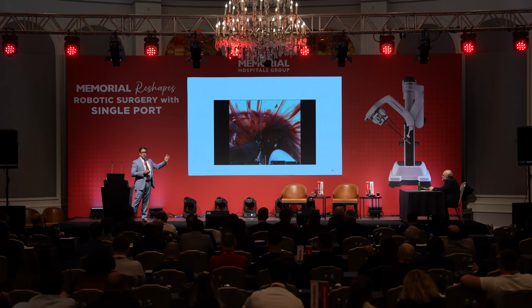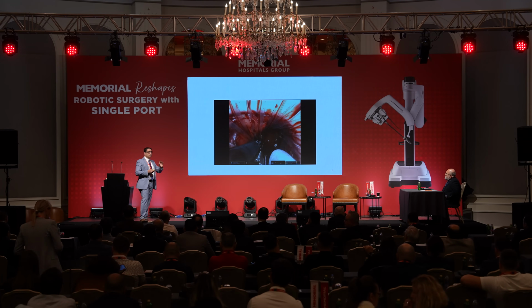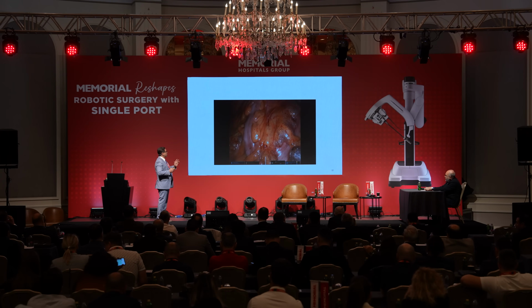This is the stoma site. I already put the bubble in. I used to use the port, the 2.5 centimeter wide and 9 centimeter long. Now they have the bubble, which saves you a ton, which is very good. It takes a while to get used to how to assemble it, though. And then you're going to go in.